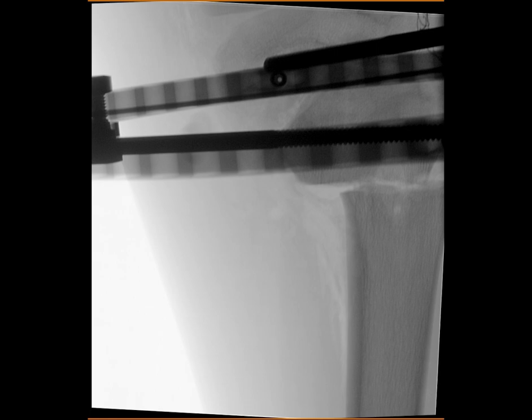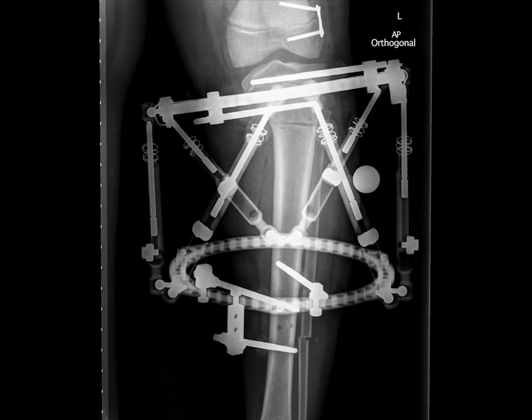Finally, we insert a syndesmosis screw and we do a fibular osteotomy for easier correction, and also we insert a plate to guide the growth on the contralateral side to correct the genu varum. All wounds will be washed and closed using Vicryl and Monocryl, and a pressure dressing applied. On the ward, we get postoperative orthogonal views of the lower limb.